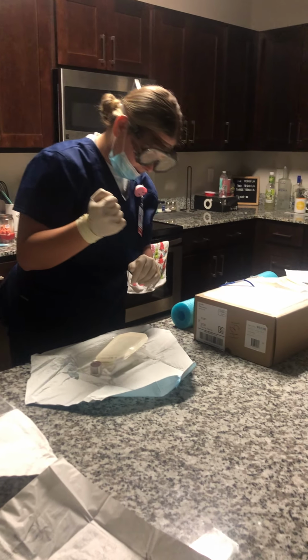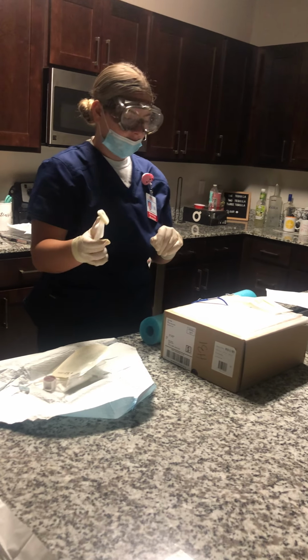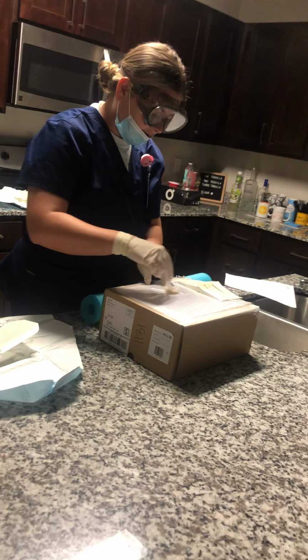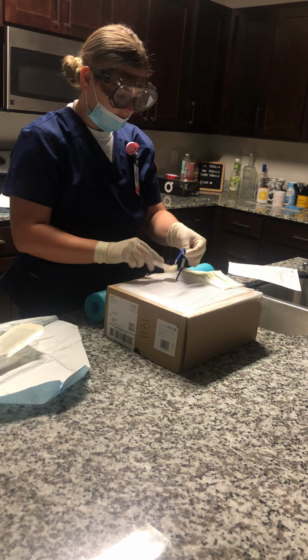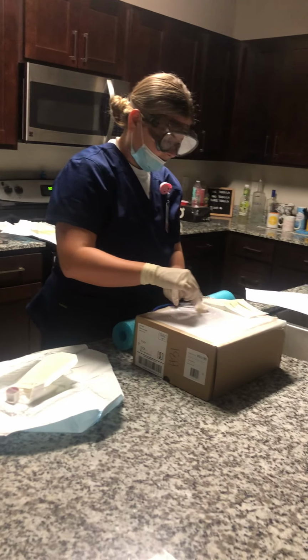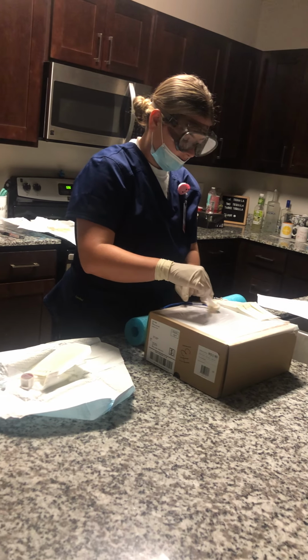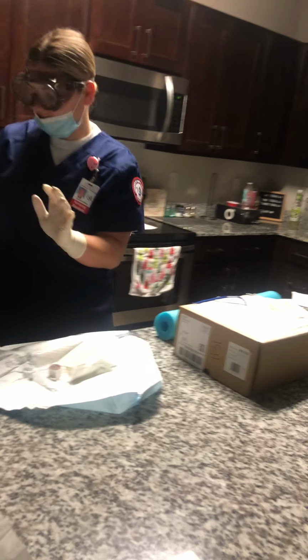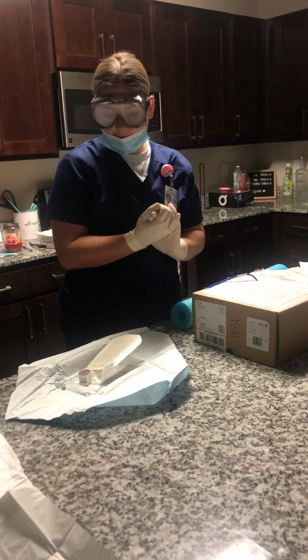And now I'm going to clean with my ChloraPrep. So with this, you want to make sure that you clean all around, horizontal, vertical. You even want to clean so you want to make sure to clean this for at least 30 seconds. You are getting the site super clean. So I'm going to dispose. So now that I've done that, I want to wait for this to dry. And I will put his bio patch on.